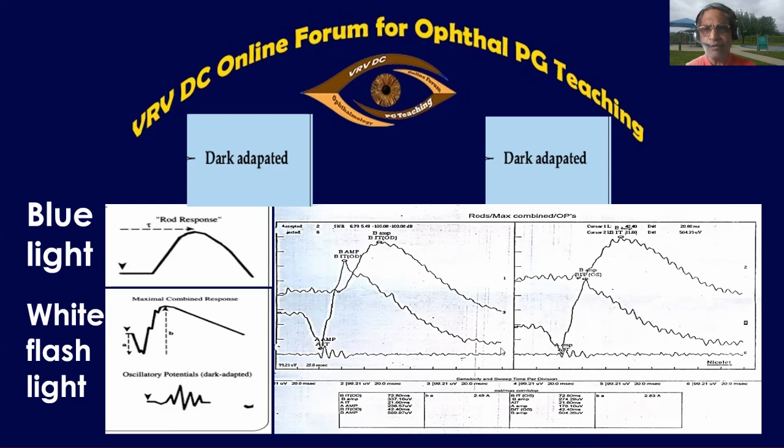That is when the light is there, then light is switched off, light is there, switched off. That means on-off phenomena. It's called the on-off phenomena, the D wave. Of course, these C and D waves are only for laboratory purposes, not for clinical purposes. For clinical indications, we have only A and B, classical.